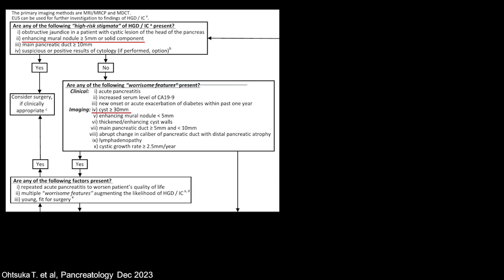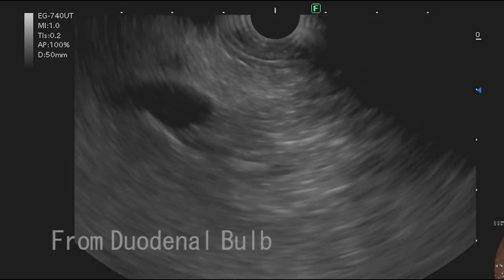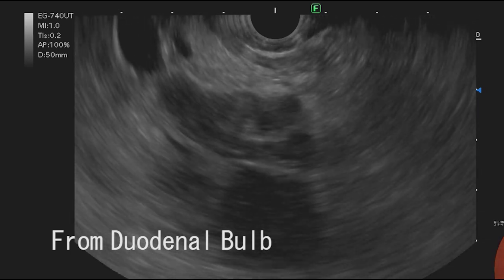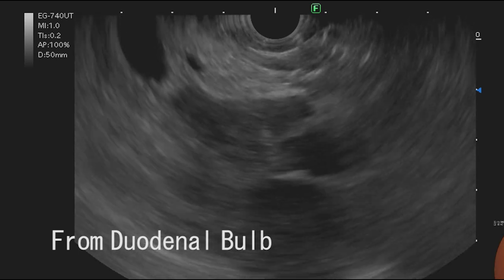Considering the presumed high-risk stigmata not clearly defined by the radiologist, and according to the size of the lesion, an EUS was scheduled for cystic fluid analysis and tissue acquisition. Using a linear echoendoscope and after passing through the pylorus from the duodenal bulb, we confirmed the presence of a multilocular cyst of the uncinate process near the head.